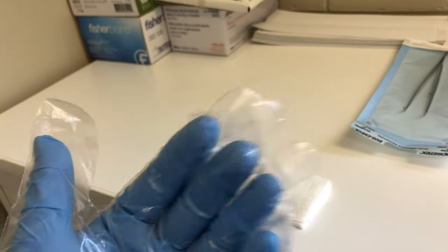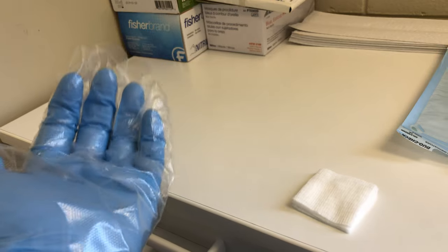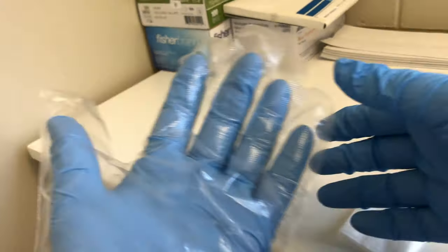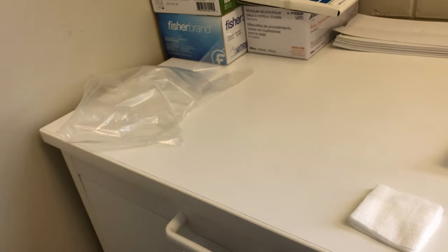Before you return to the patient's mouth, take your overglove off. Since the dirty side of the glove is the actual inside, you can just slip it straight off and place it aside for disposal.